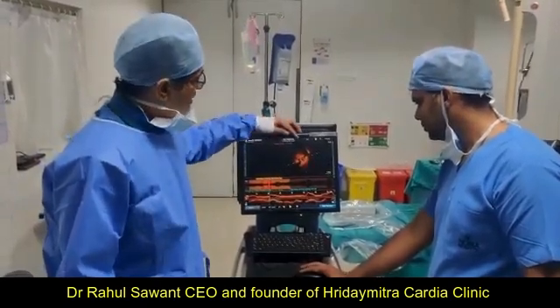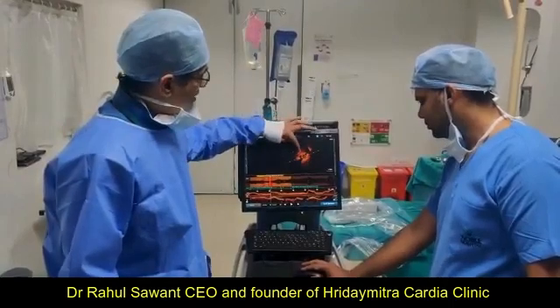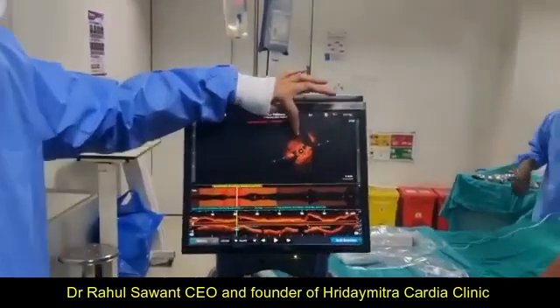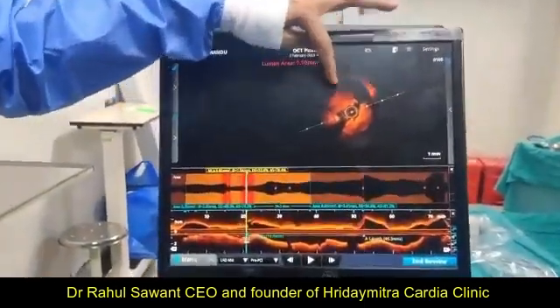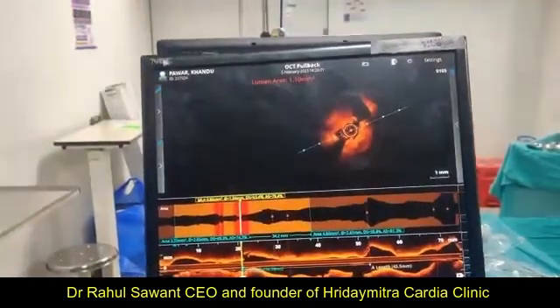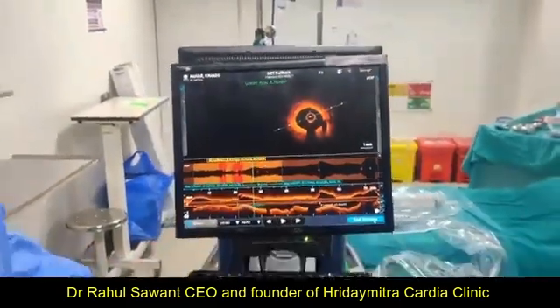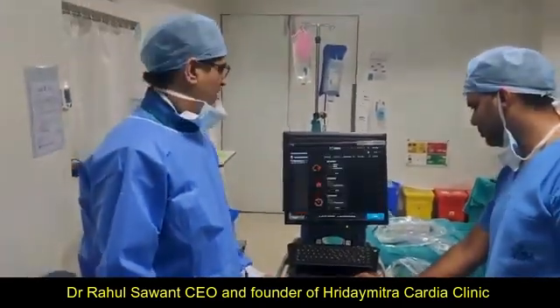Now you can see this is the tightest part. There is a blood clot from within and there is a fatty plaque deposition from outside, just in this area. There is a clot inside. This is how the vessel looks before doing angioplasty. This patient had a heart attack, and that's why we are doing an angioplasty for this patient.